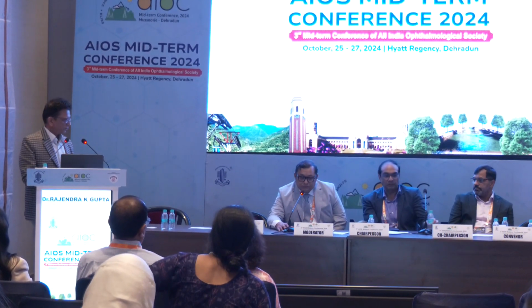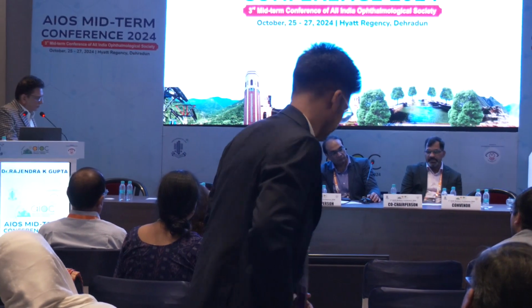Thank you, sir. In addition to this, in an intumescent cataract in a young patient, you can always see and appreciate the vacuoles. The IOL Master nowadays can also show you the entire lens thickness, where you can appreciate the same vacuoles. We also consider doing YAG capsulotomy preoperatively. If the age is more and the vacuoles are fewer, then we do lens massage preoperatively, as Dr. Husband showed. If the age is young and the vacuoles are more, and you see that on the OCT picture of the IOL Master, we do a pre-op YAG cap as well.